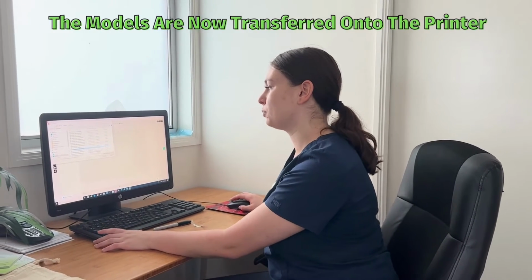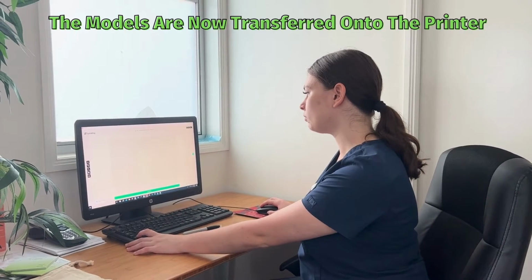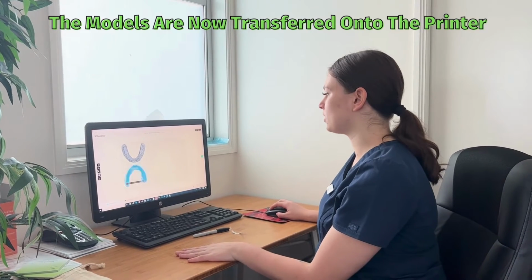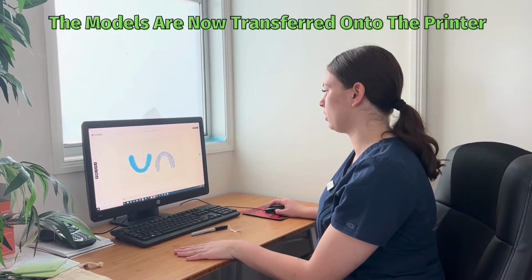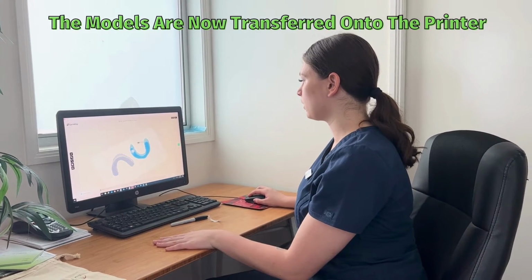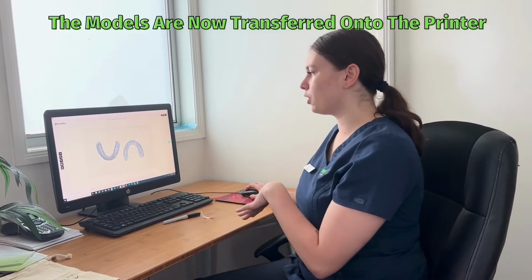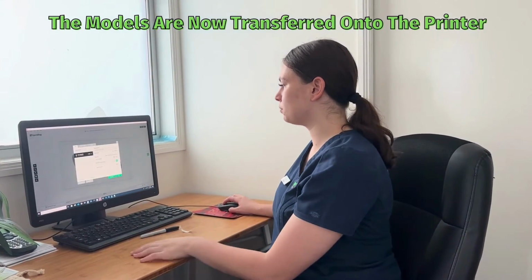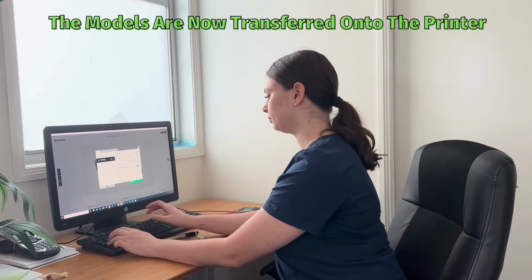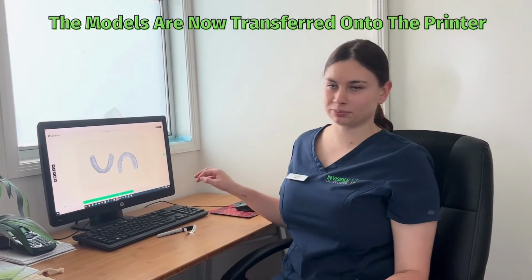So then we are exporting the models onto the software here. And then we have to follow a process to make sure that they're all based on the tray. So we move them to wherever they need to be. Then we base them so that they print properly. And then once that's all good, and you can put maybe like 3 patients on here, but we've only got 1, I just like to name it. And then I queue the print, and then we go out to the printer.